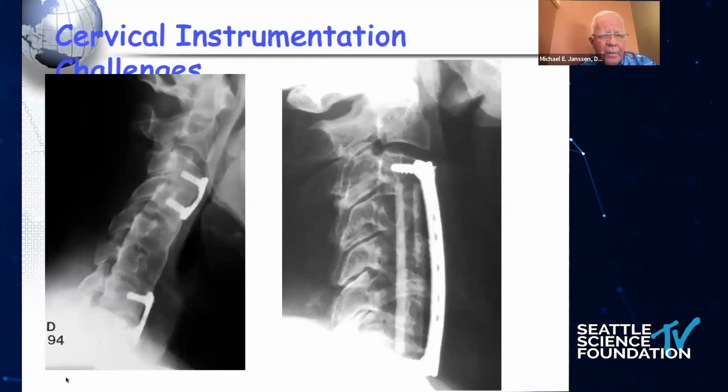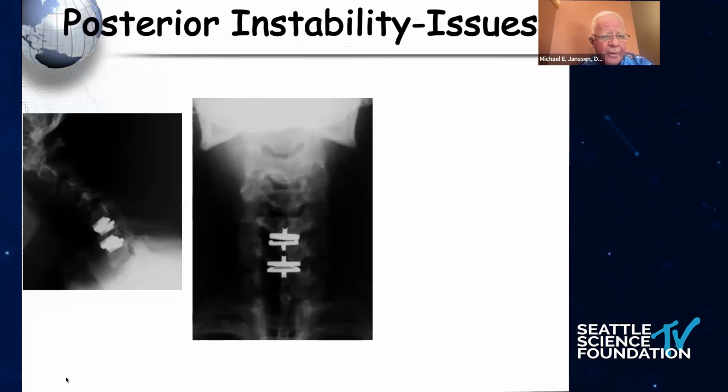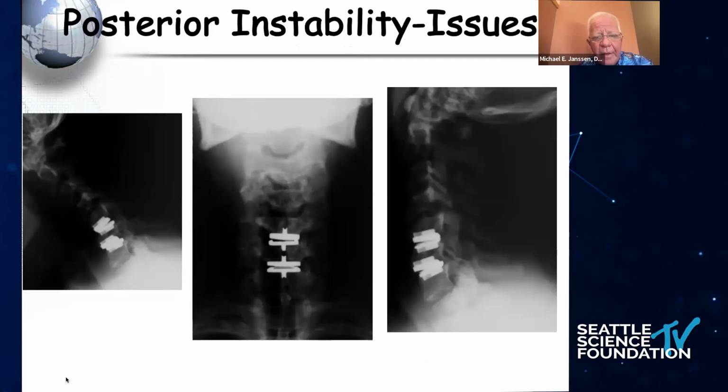So not just arthroplasty, we've seen these terrible designs like this, or techniques like this for fusion technologies over my career of 30 plus years that are less than ideal. We all know this one on the right is going to fail. It's going to piston, it's going to fail. The plate isn't going to suffice the overall biology in cases like this. But we do get posterior instability issues. Look at this case. And I think there's something happened here. And both of these look like they're in kyphosis. The inferior end plate's falling forward. Maybe it was the mixed match. I don't really see in the coronal view that it's collapsed, but clearly this is not a great overall outcome, and we would all probably think we could have done better.